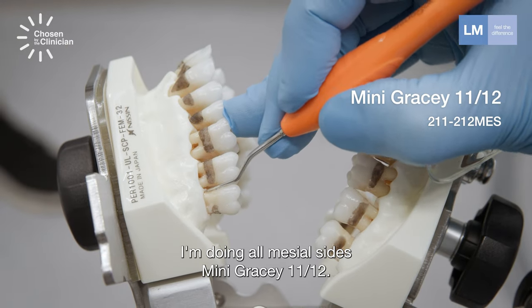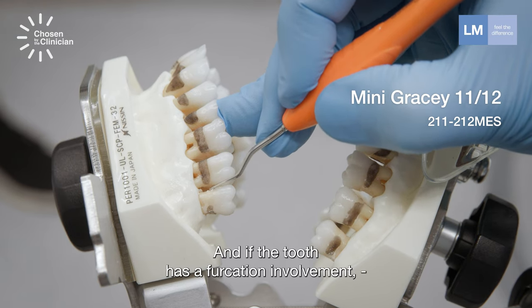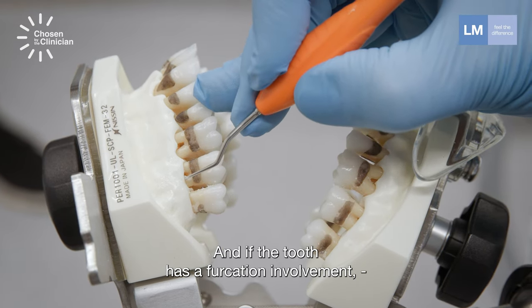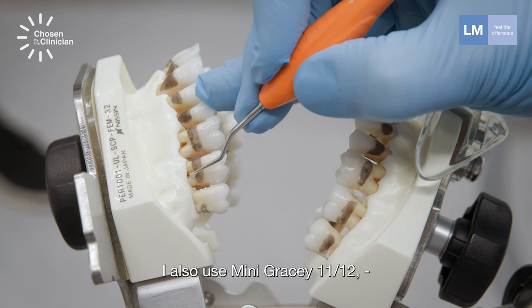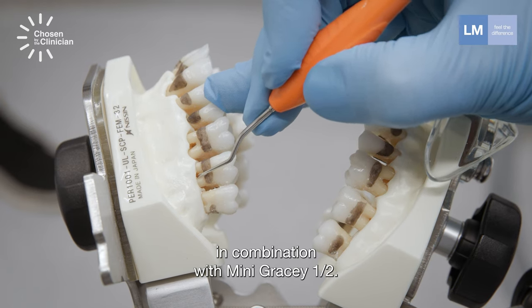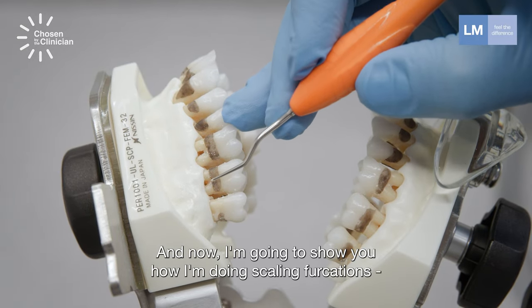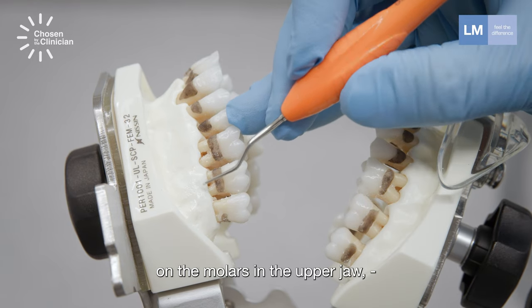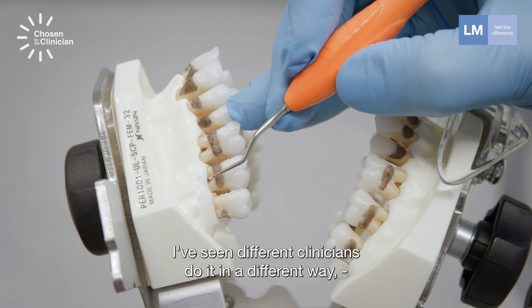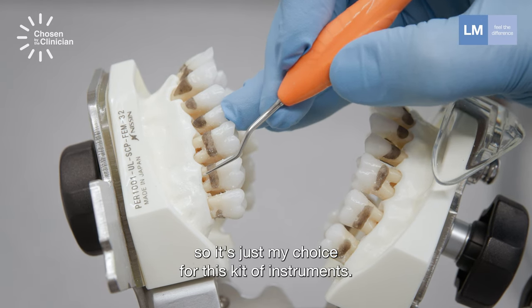I'm doing all mesial sides with mini Gracey 11-12. And if the tooth has a furcation involvement, I'm also using mini Gracey 11-12 in combination with mini Gracey 1-2. Now I'm going to show you how I'm doing scaling furcations on the molars in the upper jaw using a combination of different instruments. I've seen different clinicians do it in different ways, so it's just my choice for this set of instruments.